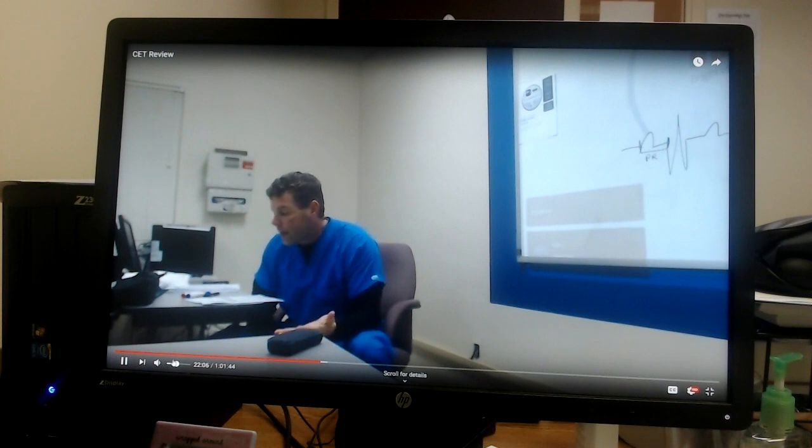Again, as far as caffeinated beverages, they don't say to avoid that. I should avoid physical activity on the day of testing. We've always told patients in the past, do your normal activities. And so I can sleep in any position while wearing the Holter. Okay.